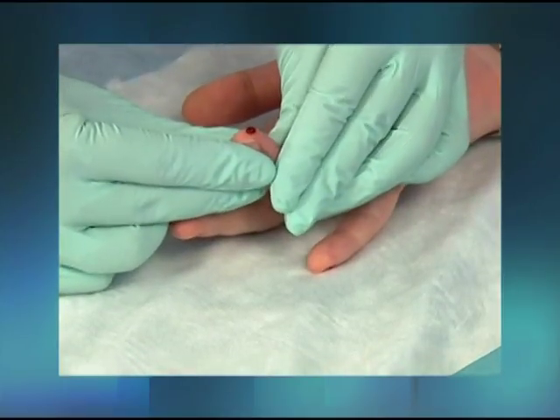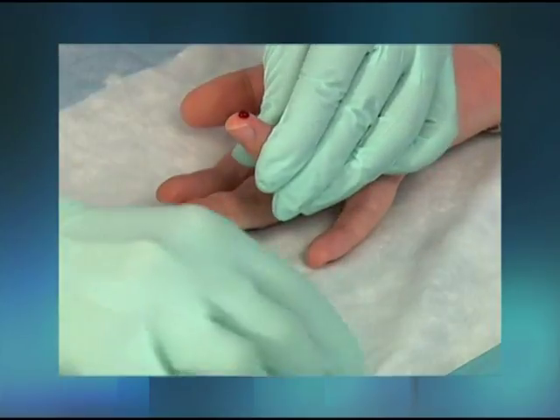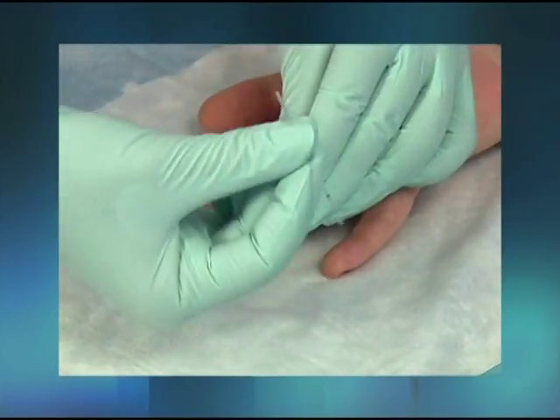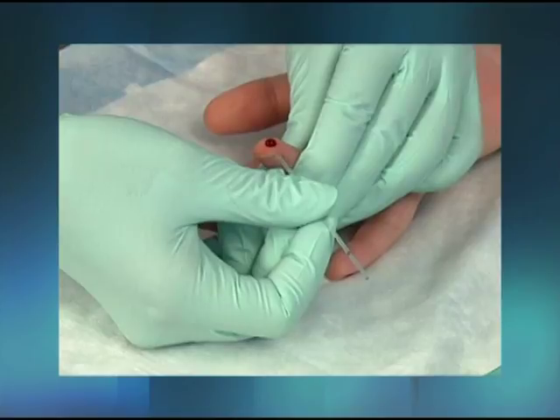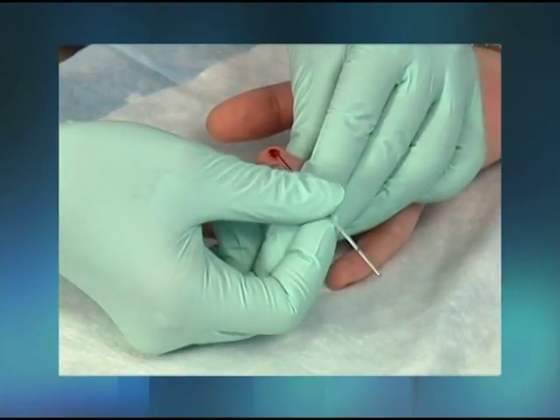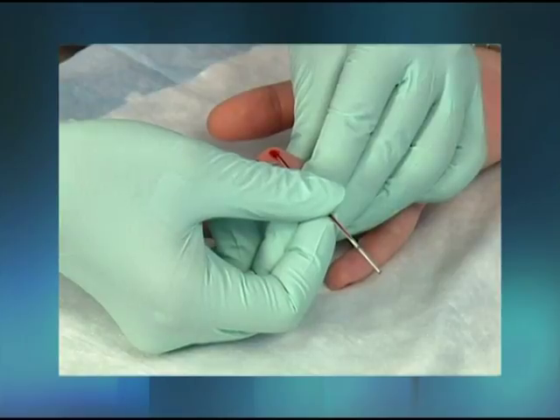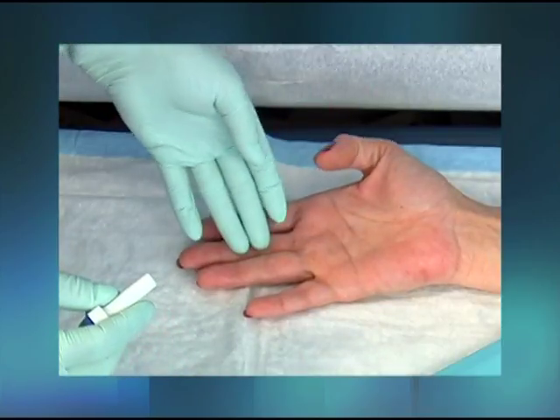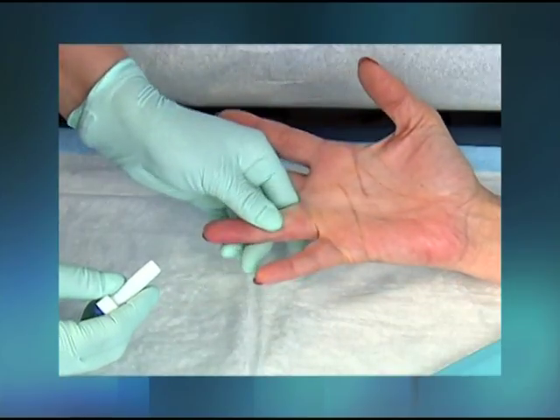Laboratory testing of a capillary blood specimen is often performed in the medical office. Examples of such tests are hemoglobin, hematocrit, glucose, and cholesterol. A skin puncture must be performed to obtain a capillary blood specimen. The medical assistant is responsible for performing skin punctures in the medical office.